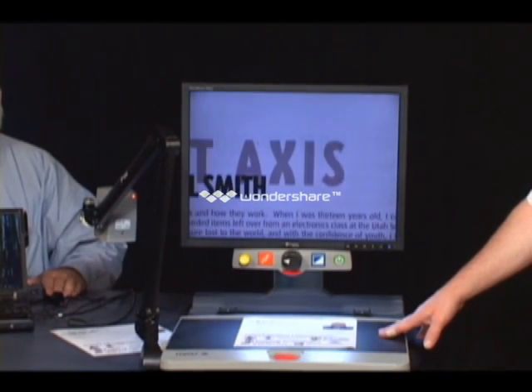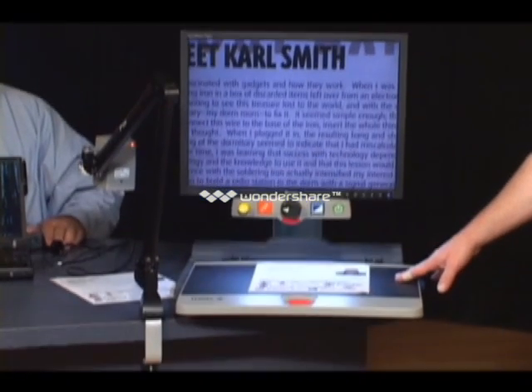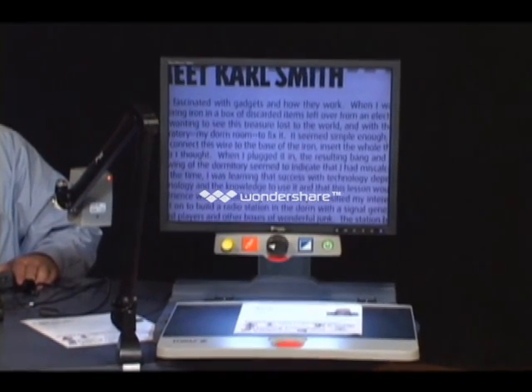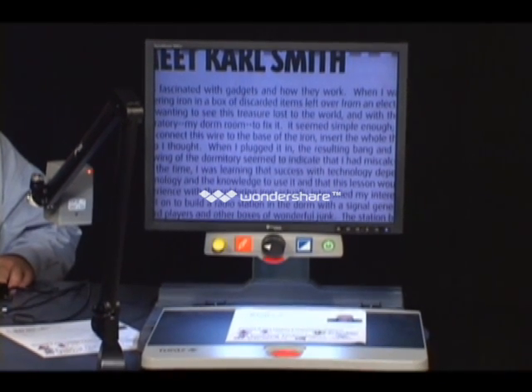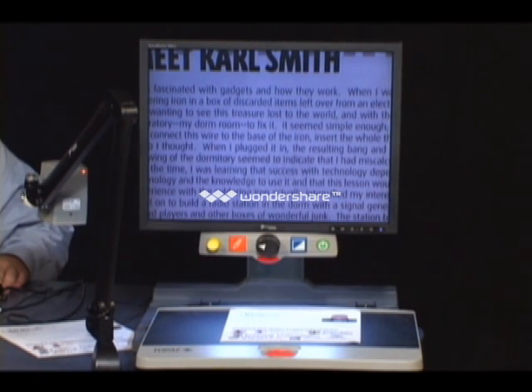It is one of the things that is now sort of common in the industry: these machines have been designed very simply. Those of you who've been around as long as I have may remember some of the earlier ones, which had all kinds of switches and knobs and things on them for all sorts of neat features. And they discovered, actually it was Telesensory that did some actual research on this back in the 90s to find out what people really used and what they didn't use. They discovered, after they'd been building all these fancy machines for years, that most people weren't using most of the features on them. So they very much simplified the product.